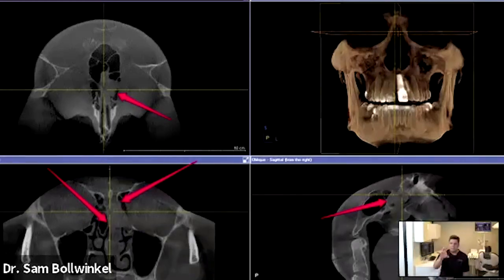With a cone beam, I was able to see this image and give proper direction to the patient. When they went in to remove this mass, this carcinoma had penetrated his septum and was just starting to penetrate the base of the skull. They were able to surgically remove it completely, hit it with a little bit of radiation, and 100% recovery.